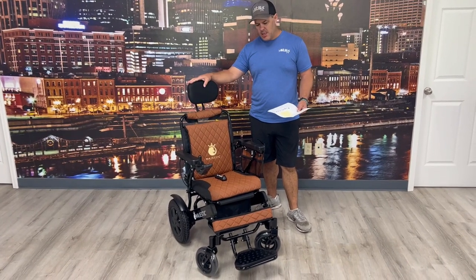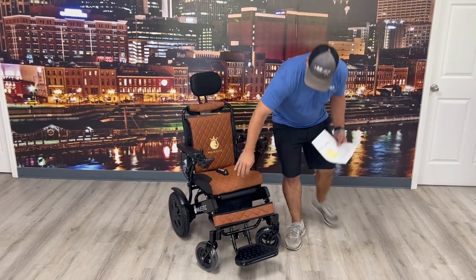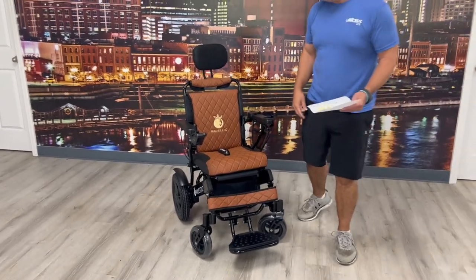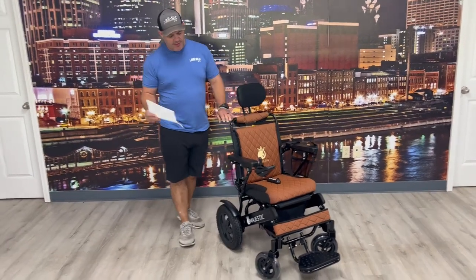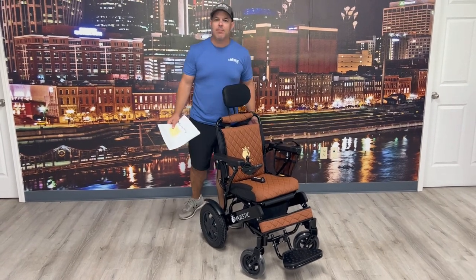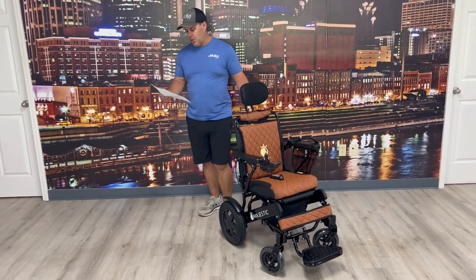This one comes with a headrest on the back, an arm pouch, and also a pouch underneath for some storage space. This one will go up to four miles an hour — we'll show you that in a few minutes. You have an overall width of 23 and a half inches, so you won't have any problem going through door frames and things like that. Plenty of room to go through there.